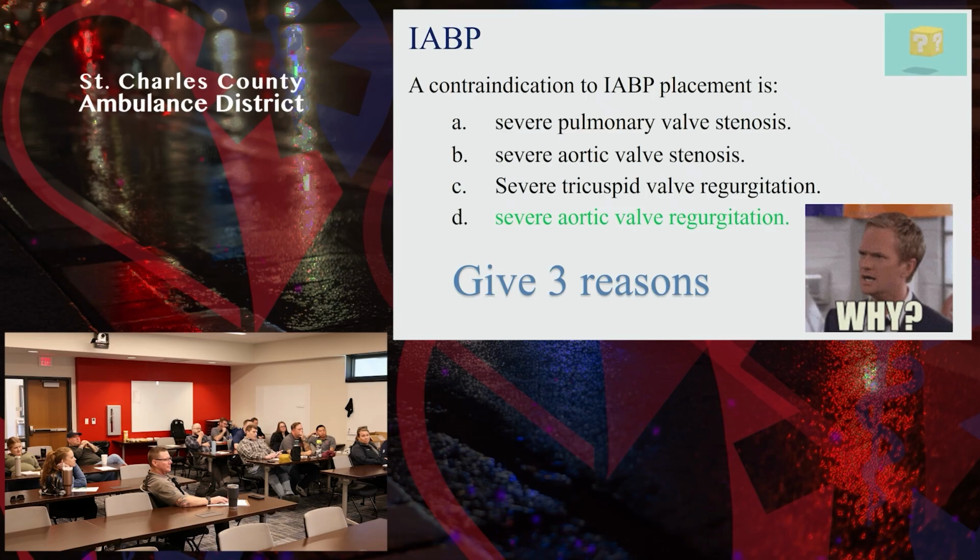So, okay, I'm going to keep asking questions till I stump you. Stump him. Yeah. The dicrotic notch, okay, it assumes the transducer is where? In the right place, yes? Well, that's one of those guess what I'm thinking questions. Let me ask a better way. Is the transducer going to be in the aorta or in the femoral artery? Oh, it should be in the aorta. It's in the aorta, okay?